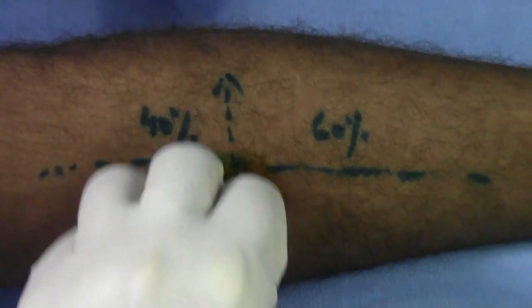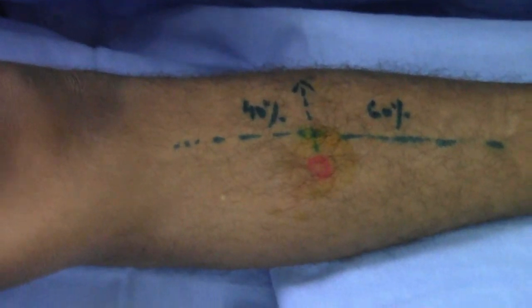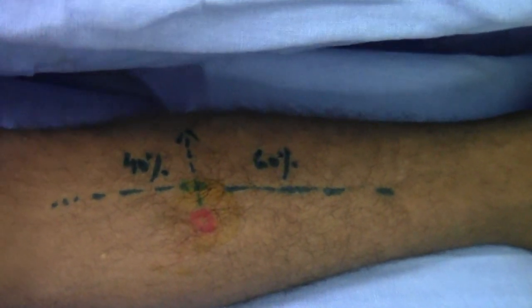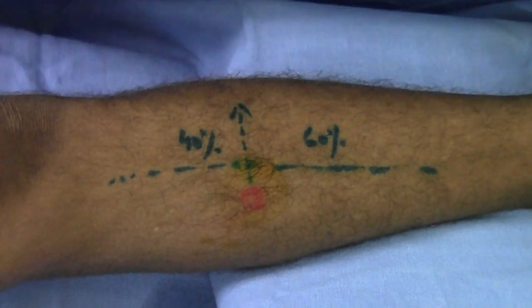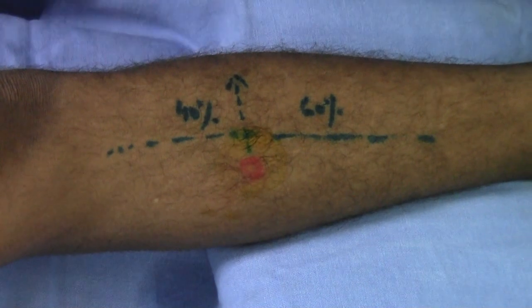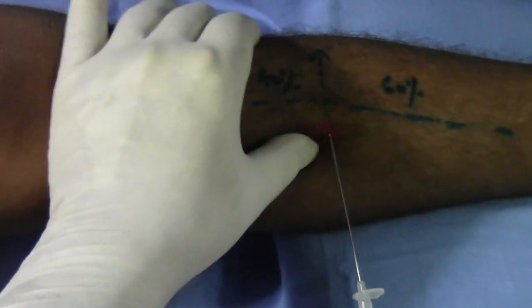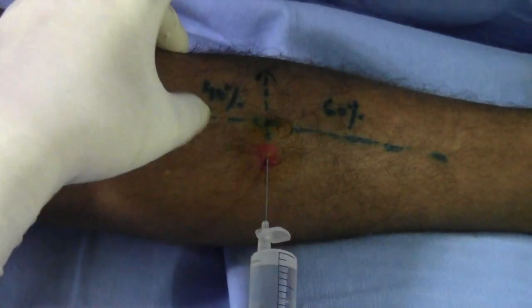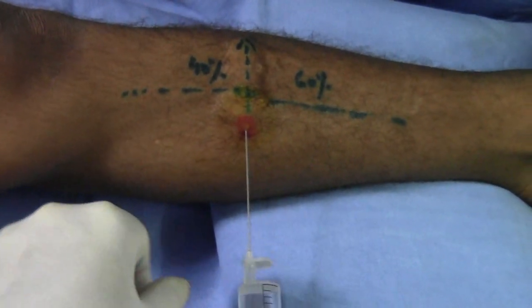Just massage this area. Now I will inject the saphenous nerve from the same point. From this point, infiltrate this area subcutaneously to anesthetize and block the saphenous nerve — the needle has been withdrawn and injected subcutaneously here.